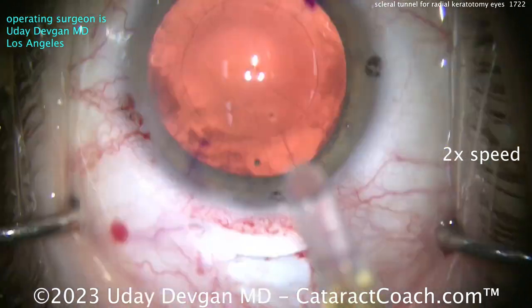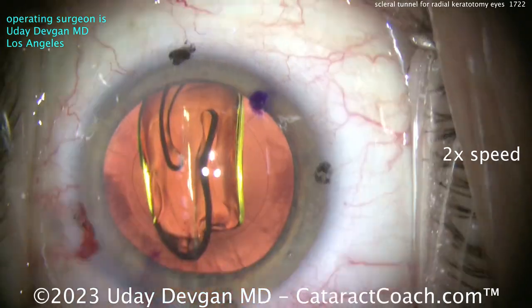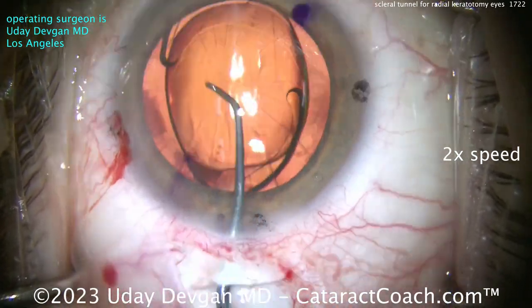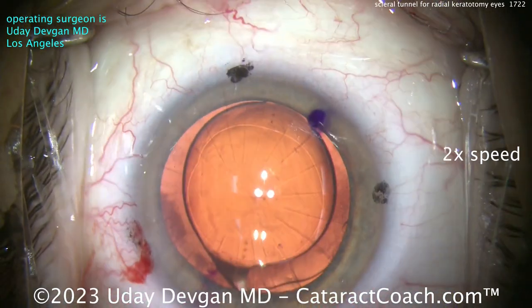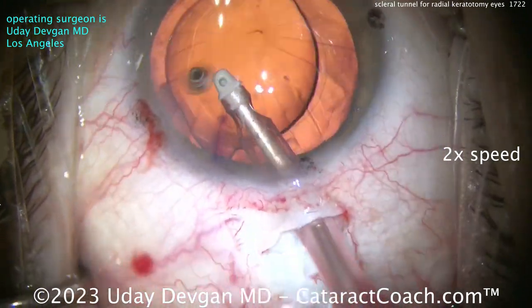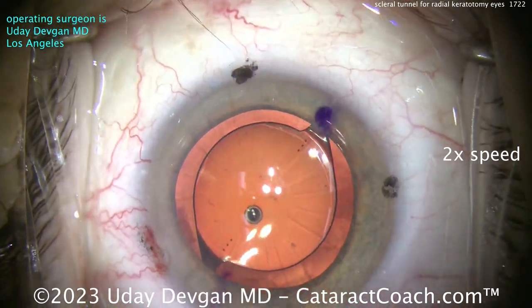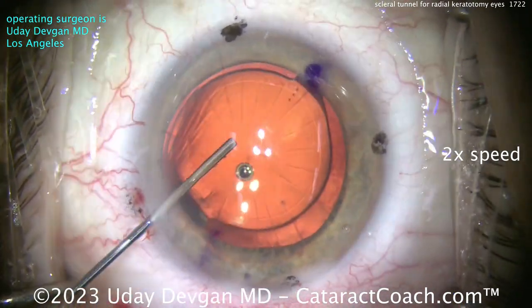Lens calculations are not normal in RK eyes like this, especially with this many cuts — so you need to do some homework. On CataractCoach.com there are a lot of videos that actually show you my way of doing the calculations. I'm giving you all my secrets already.